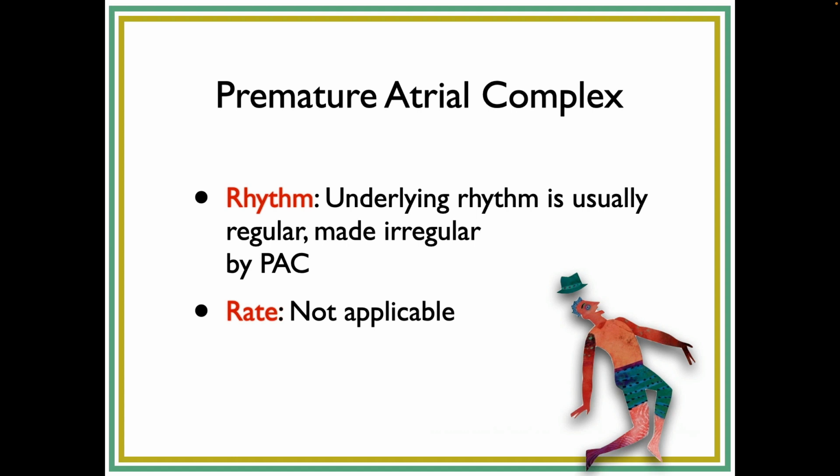Why is that a little bit inaccurate to say when we're looking at an ECG strip and we see a premature atrial beat, to call it a contraction? Just electric. Remember, it's the same reason why we say that the P wave does not represent atrial contraction, it represents depolarization. Because ECG is just electrical activity, okay? So, anyway, most people just call it a PAC anyway, so it doesn't matter.